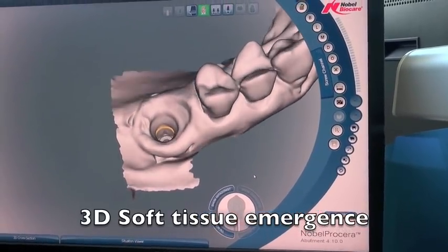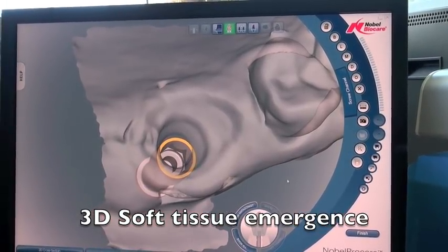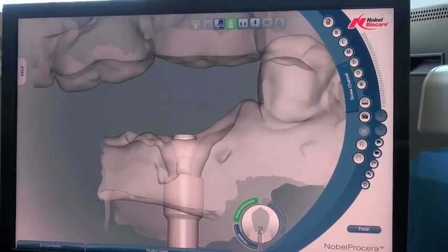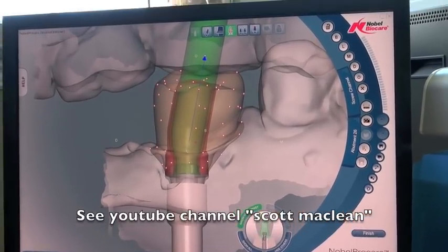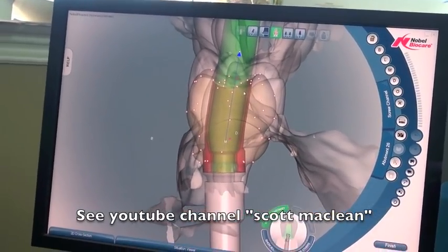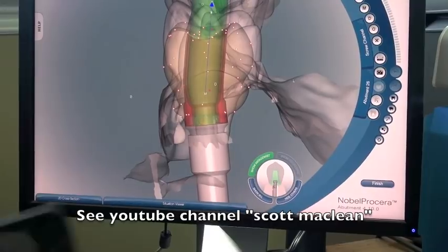We're able to scan the soft tissue model into the Nobel Procera scanner, and this enables us to see exactly how we want to shape the new abutment. My dental technician Mike has taken the liberty of doing this quickly for us. You can see this on another YouTube video I produced, but we actually designed the abutment so it's going to follow that soft tissue contour.